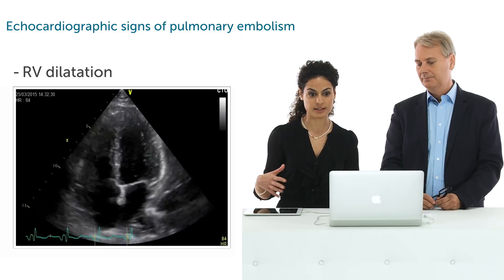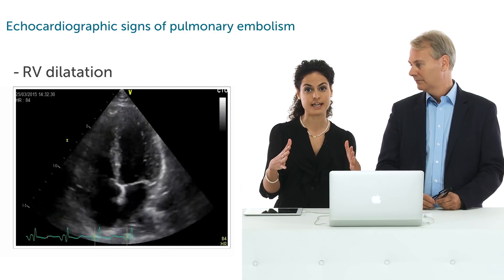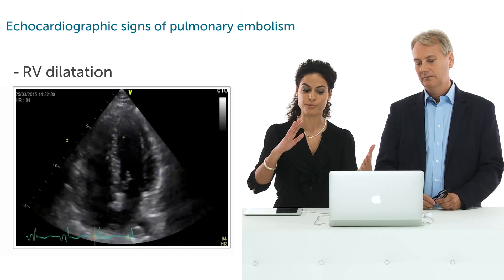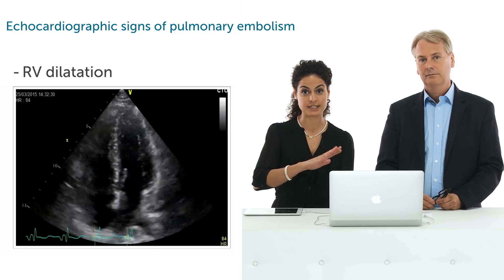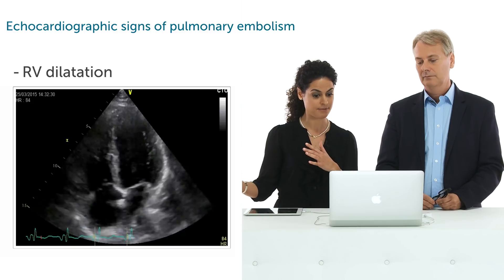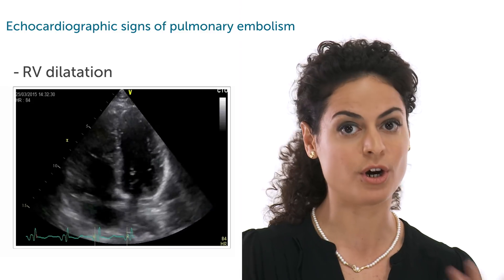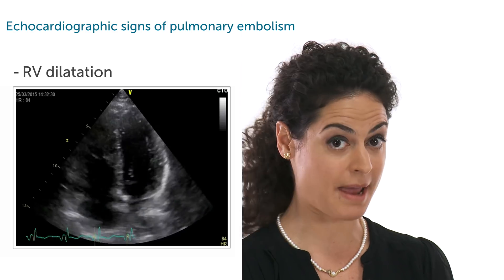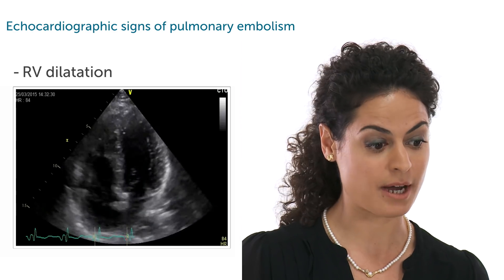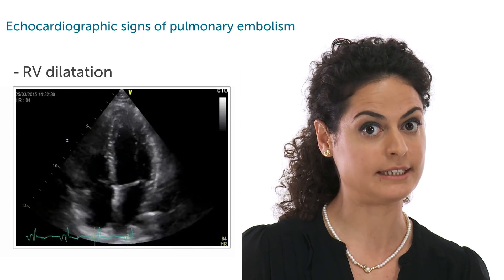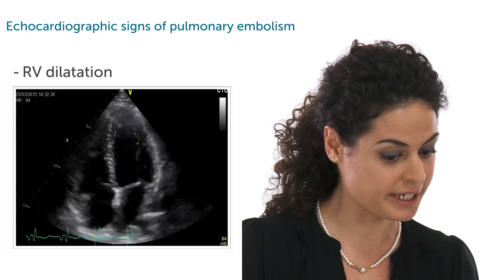We see that there's also right ventricular dilatation. If you compare the right ventricular size with left ventricular size, the normal ratio is not respected. So we can talk about right ventricular dilatation even without measuring.